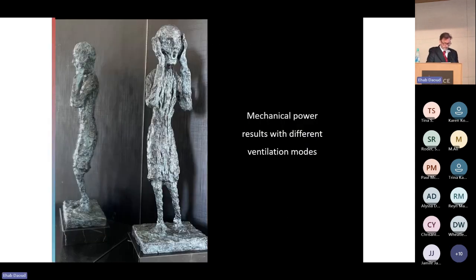But our show has just started, because this is not so logical. There is a tendency to replace the concepts based on tidal volume and pressures with understanding mechanical power as a VILI generator, but its predictive accuracy is still unclear. As we will see next, the results with different ventilation modes.